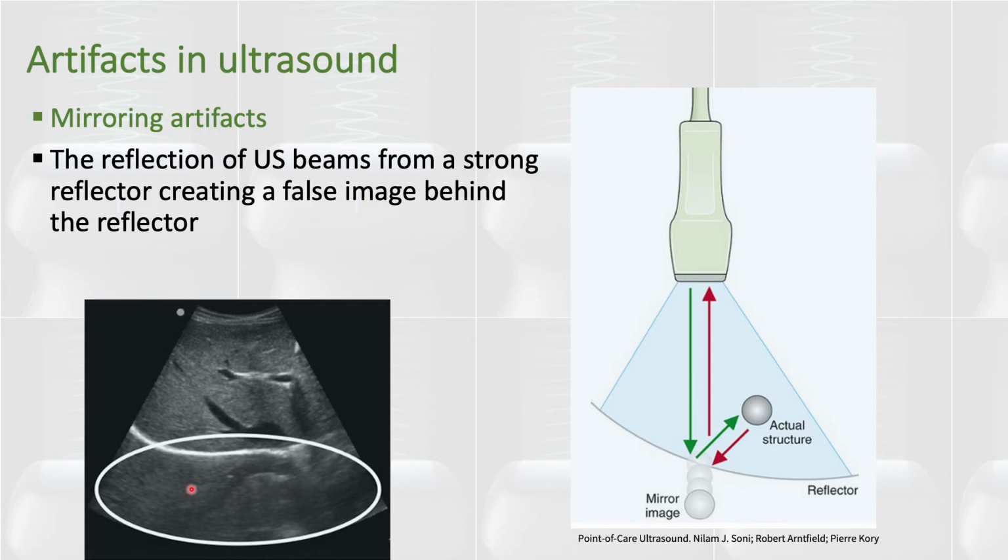So this is really important. Sometimes this can be confusing in someone who is doing ultrasound for the first time, and you might think that there is a pathology or a structure here, but there is not. It's just a mirror artifact.